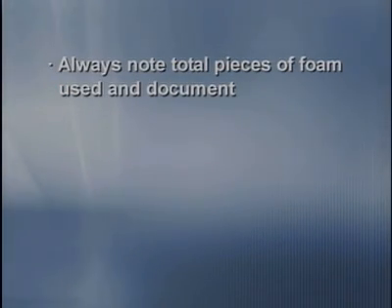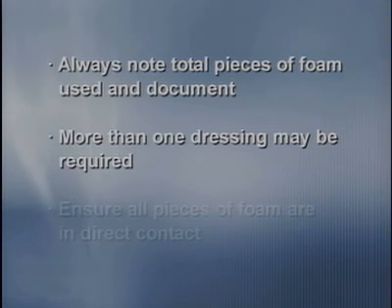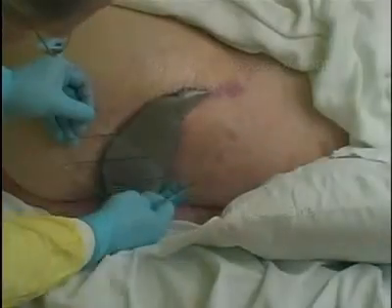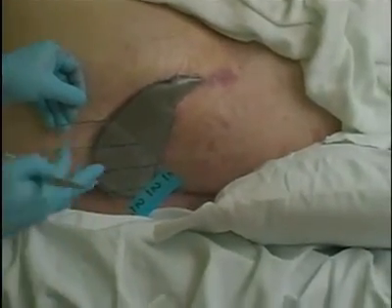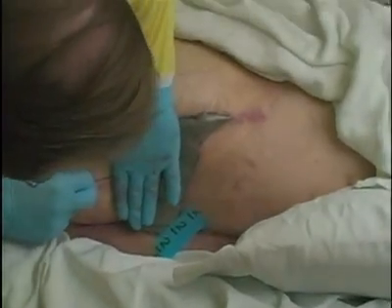If the wound is larger than the largest dressing, more than one dressing may be required. Ensure the edges of multiple pieces of foam are in direct contact with each other for even distribution of negative pressure. Size and trim the drape to cover the foam dressing as well as an additional 3 to 5 centimeter border of intact parawound tissue.